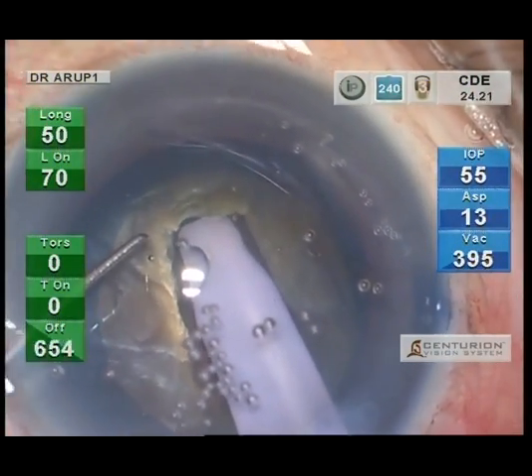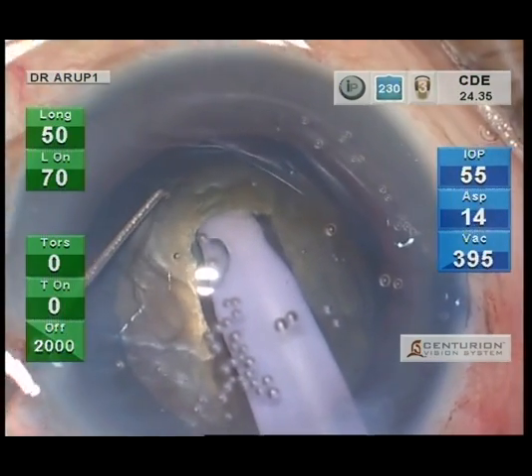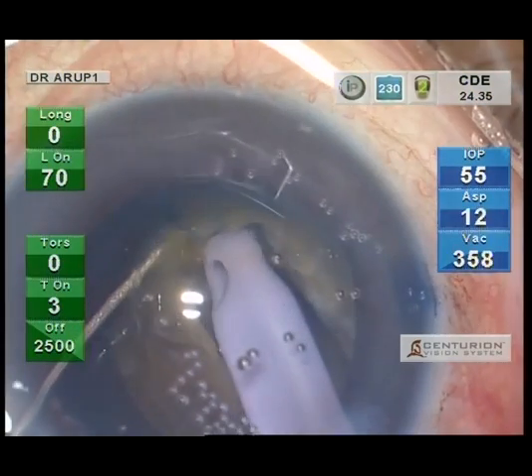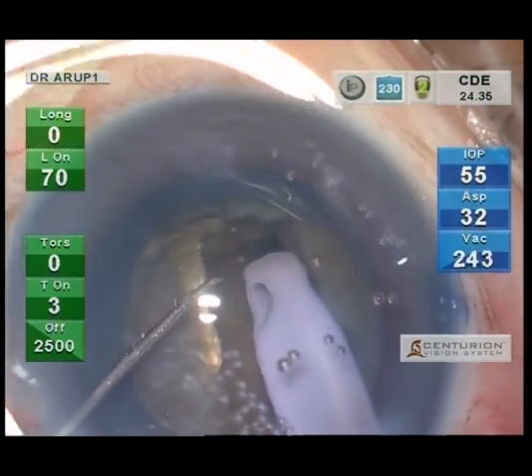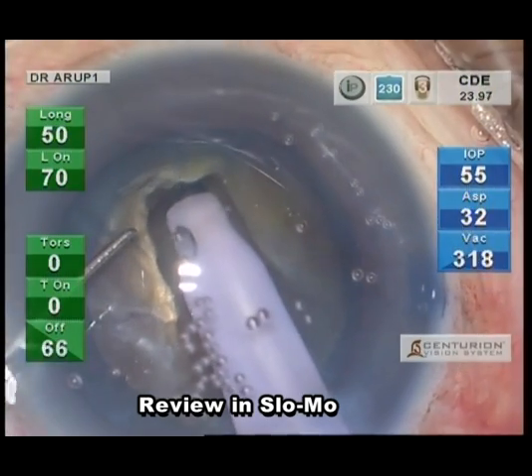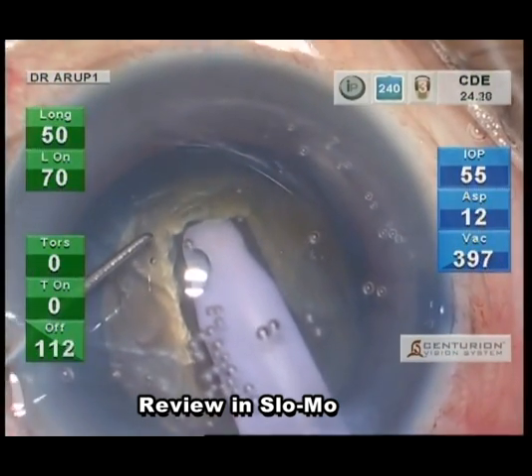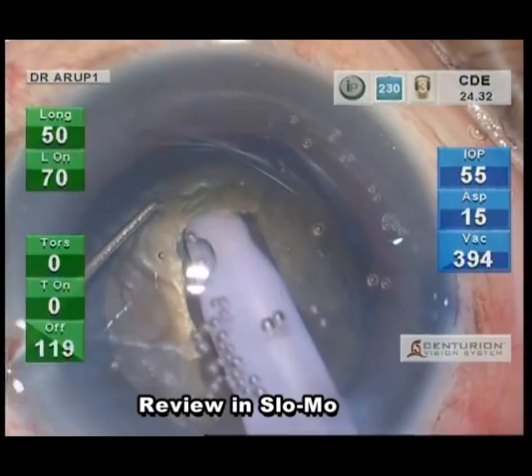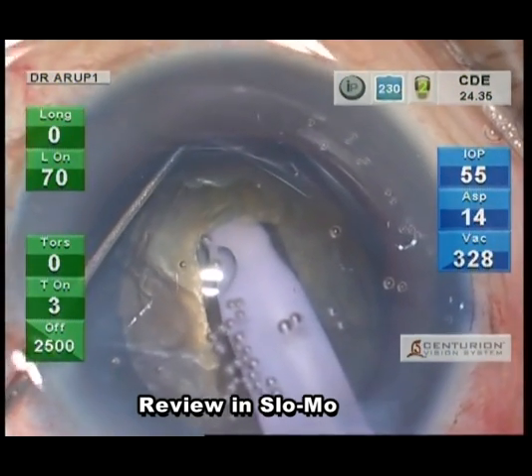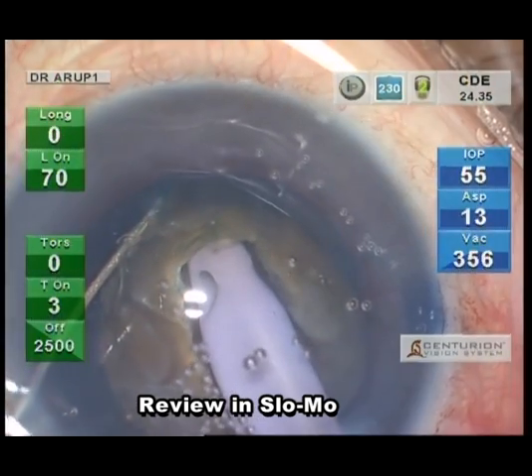The chopper, after engaging the nucleus surface, slices down towards the phaco tip, and just before the two tips come together, they are moved away from each other, thereby creating a cleavage line which propagates towards the center. It is not necessary to struggle to have the cleavage line run all the way across to the opposite periphery at this stage itself.